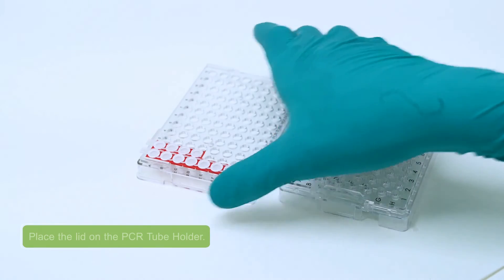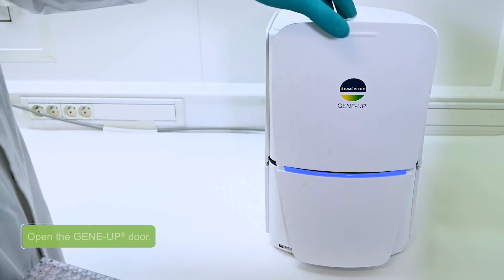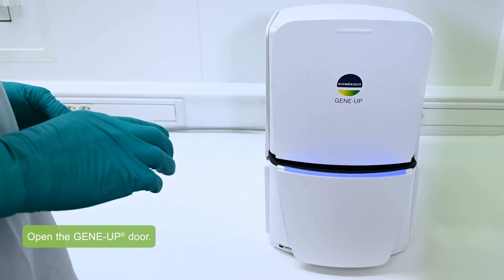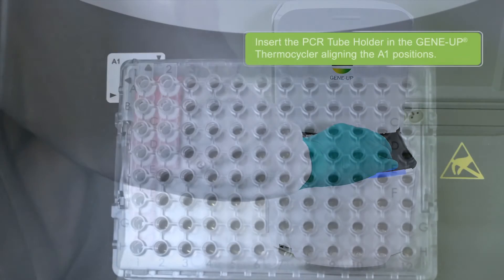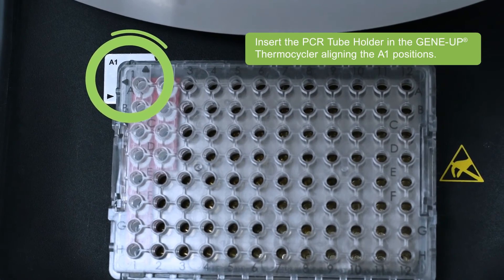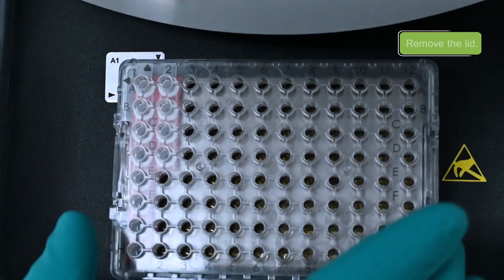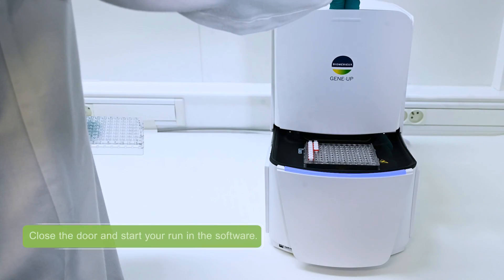Place the lid on the PCR tube holder. Open the GeneUp door and insert the PCR tube holder in the GeneUp Thermocycler, aligning the A1 positions. Remove the lid, close the door, and start your run in the software.